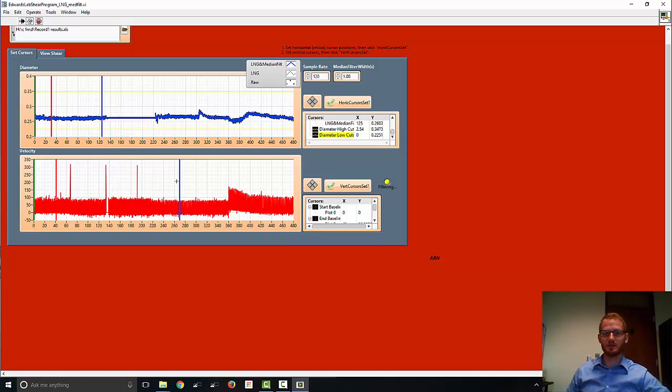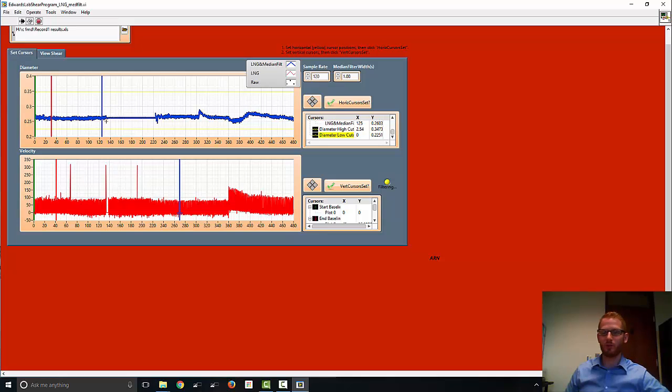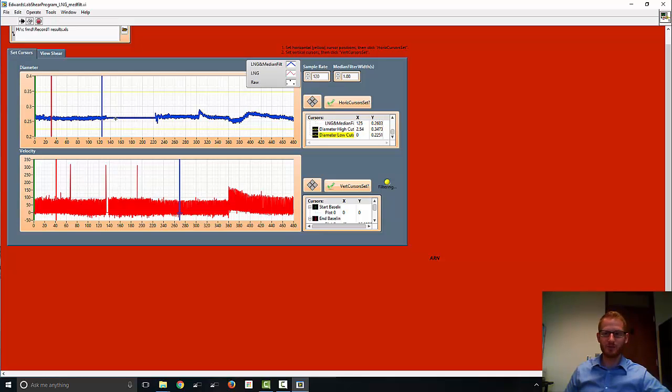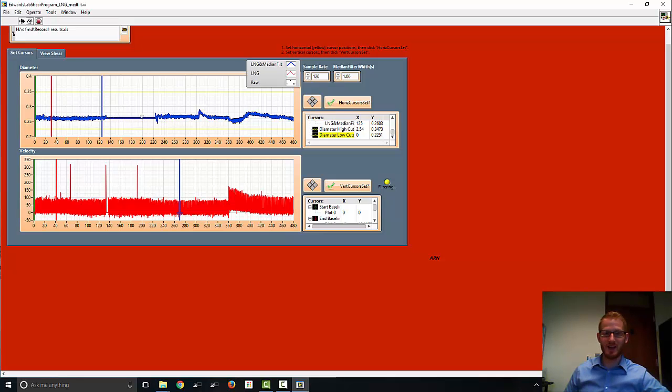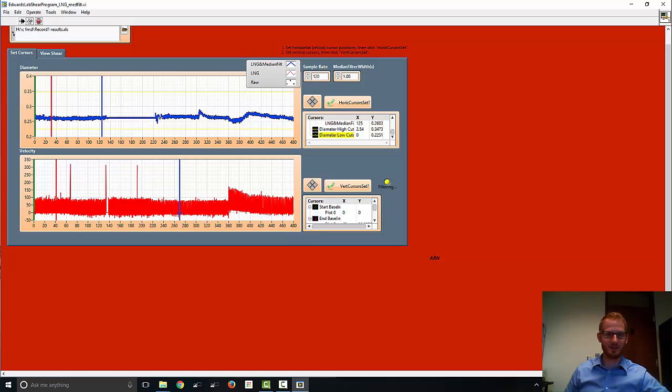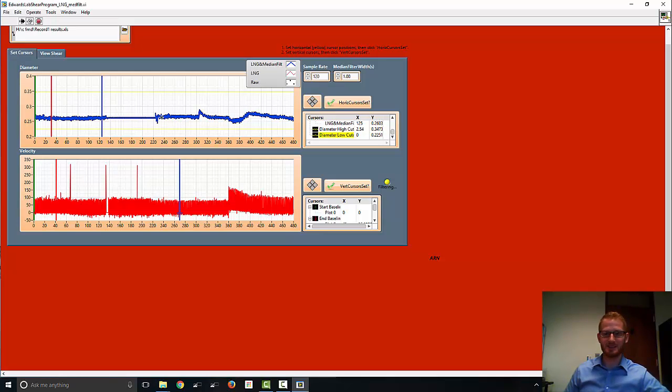Alright, so now we have something that actually looks like an FMD. So there was a point during the video, we didn't see it earlier when I analyzed it because I didn't analyze the whole video, but there was a point during the cuff occlusion phase where the ultrasound froze up on me for a short period of time, so we lost data here. Fortunately, we don't really care about the data during the cuff occlusion time. Sometimes we'll look at the data right before the cuff is deflated, which occurs right here. But generally speaking, this is not a big deal. We're not going to be using it. What does matter is if you ever lose the data, you want to make sure that it comes in at about the same size of the diameter as what it left as. That means that you didn't lose the image. You're not collecting data on a slightly different version of the same vessel or even a different vessel altogether. So the fact that this went away and came back before we were going to analyze the data, it's still the same approximate diameter. I think we're good to go here.